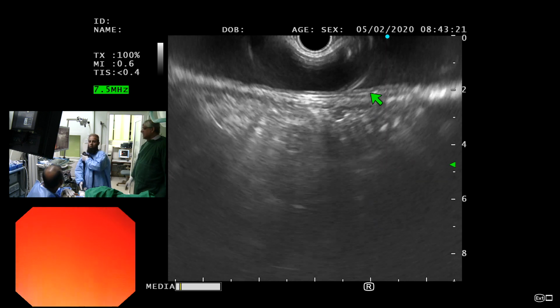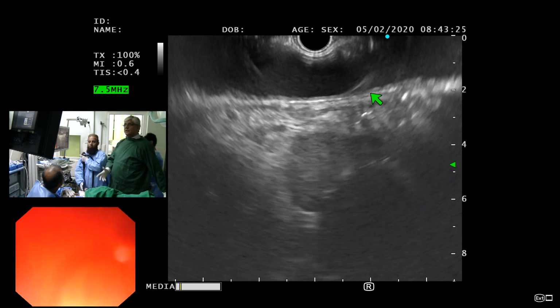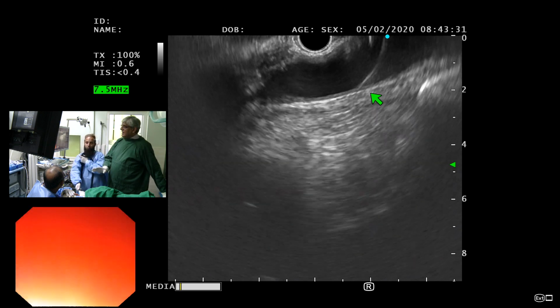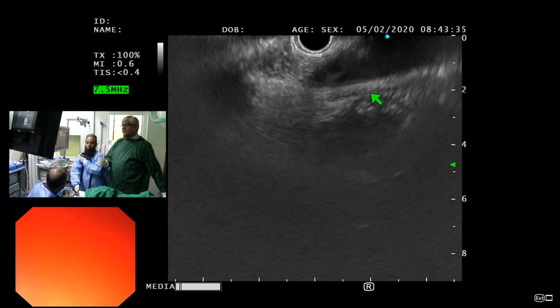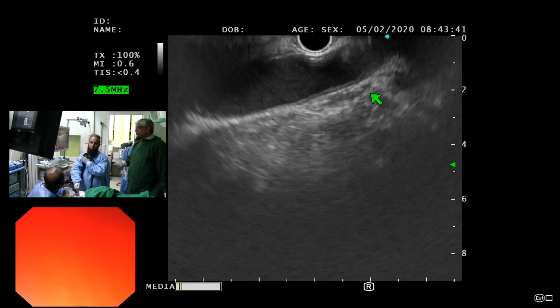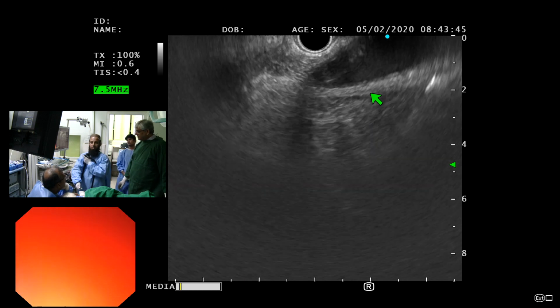There you are. You cannot miss. With a little bit of practice, and what I do is I go in women 35 usually at the GE junction. I go at 40, and that's where I tip up. You see the liver, rotate clockwise, and you will almost always see the aorta, and then you follow the aorta. Is that good? Yes. Understood?